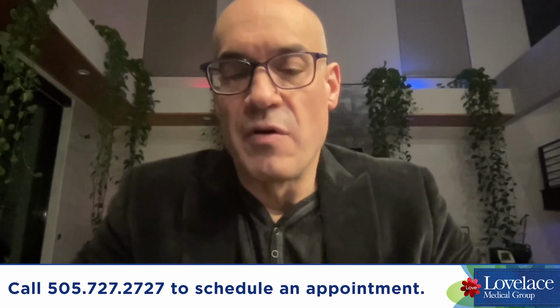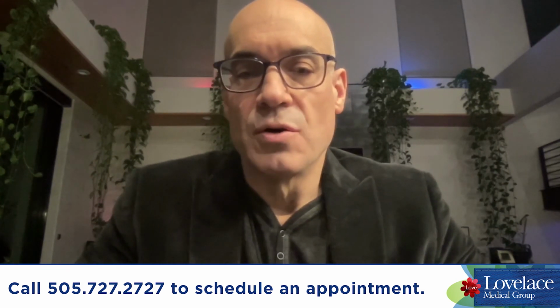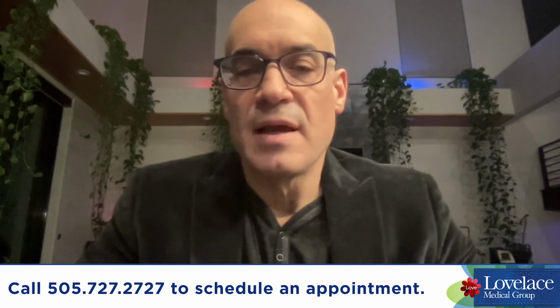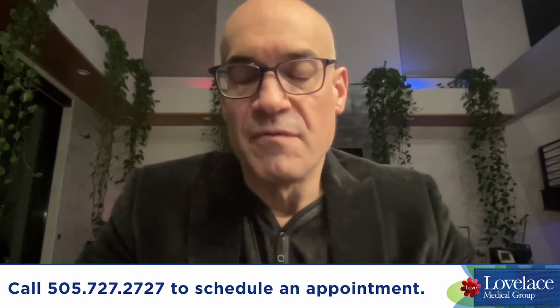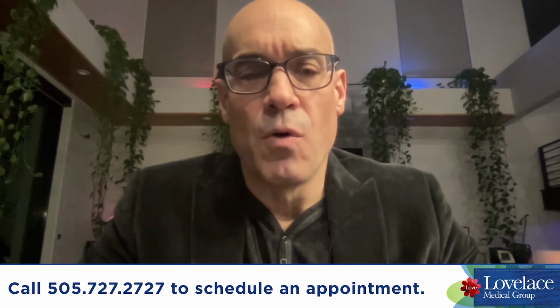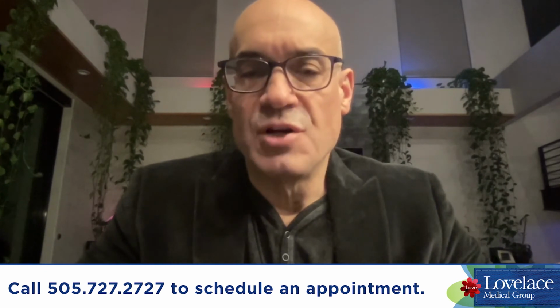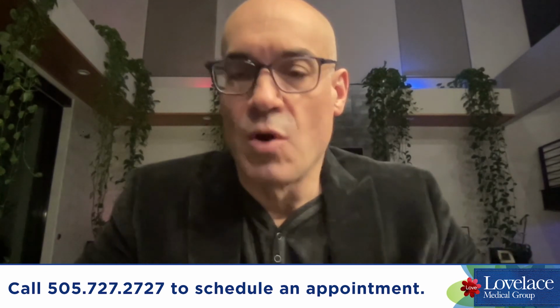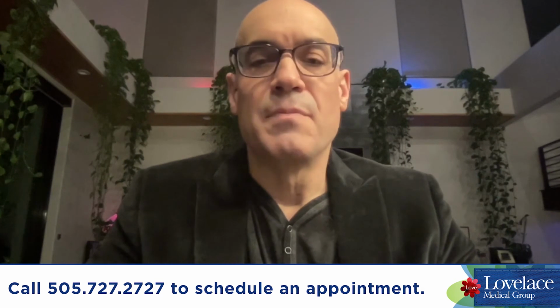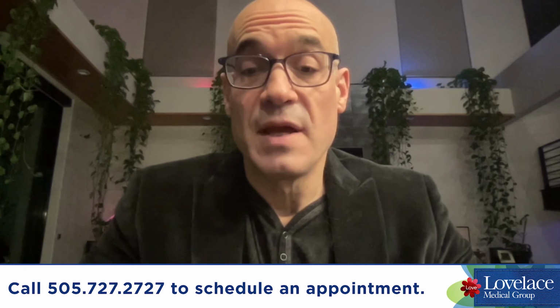What happens if you have a very big prostate? We measure prostates in gram size, and generally the laser vaporization procedure works well on prostates that are above 35, 40 grams and up to about 80 grams. But as you saw in that video before, the laser energy is hitting the tissue, and there's a lot of energy transfer into that tissue the larger the prostate. Just think about it: bigger surface area, more energy transferred to the patient.